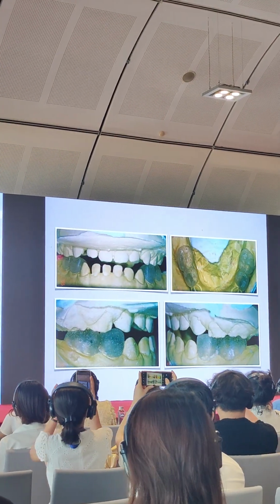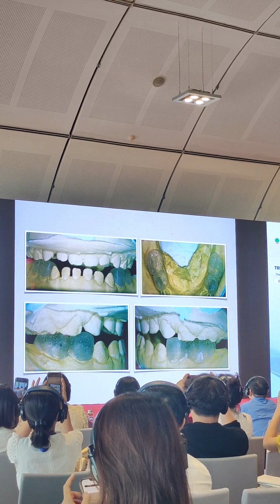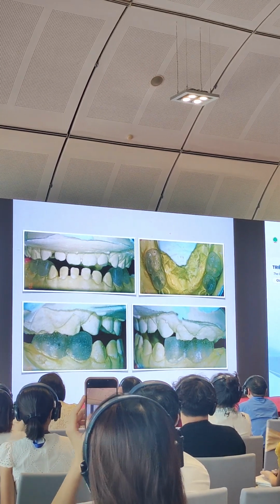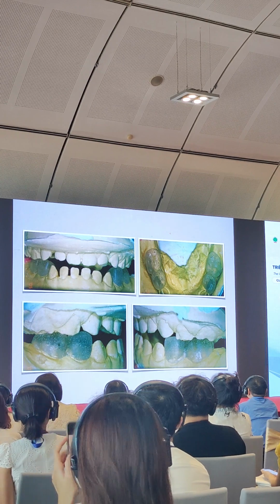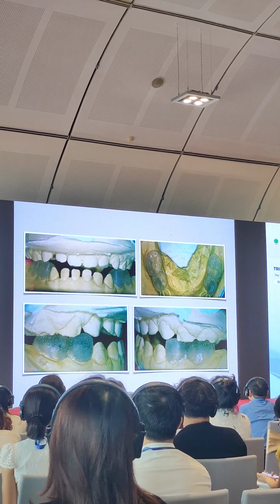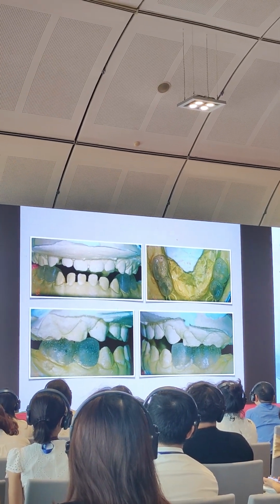So unfortunately, because I don't do any general dental work, I only have clear retainer, clear acrylic in my clinic. So I use the clear acrylic, self-cure acrylic, and then it's ready for the patient when they come back.